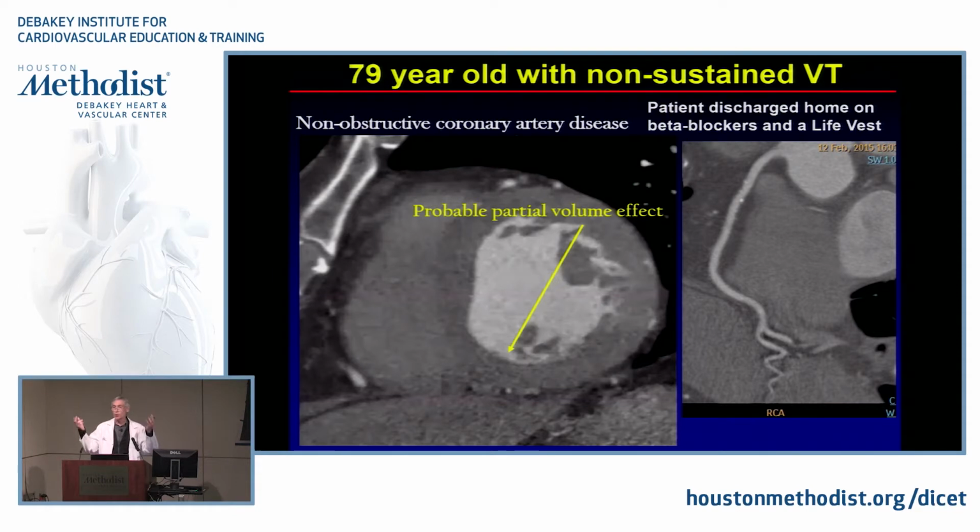Now, does anybody know what a partial volume effect is? No, nobody knows what a partial volume effect is. Okay, so the bottom line is that when you do imaging, and you look at just a static image, you're looking at the entire cardiac cycle, right? You're looking at systole and diastole, right? And if you have abnormal wall motion, when the myocardium contracts in the normal areas, it gets much brighter, right? And when it contracts abnormally, it's going to be less bright. Correct? Correct.